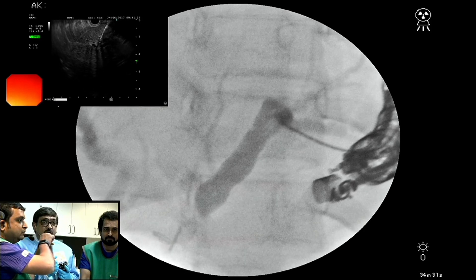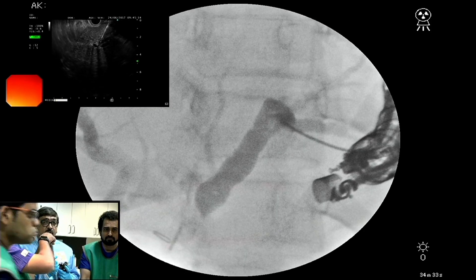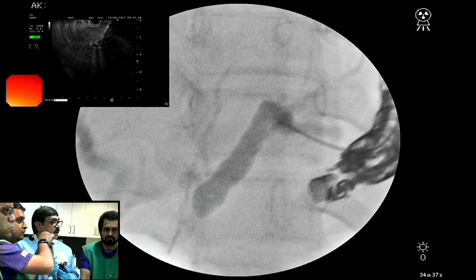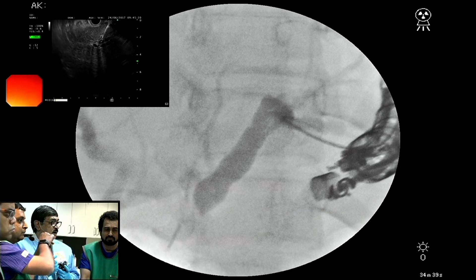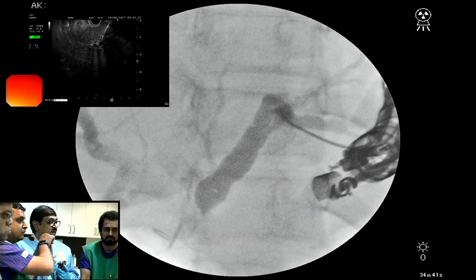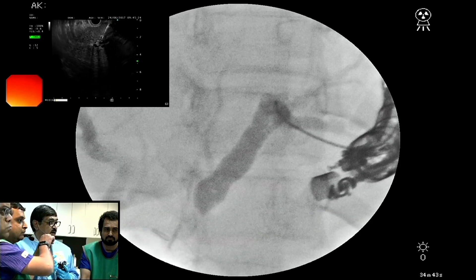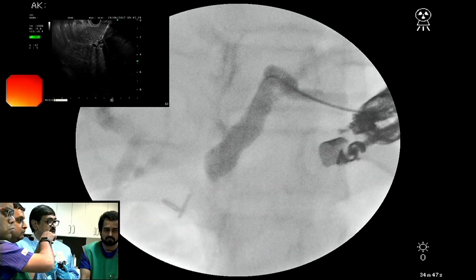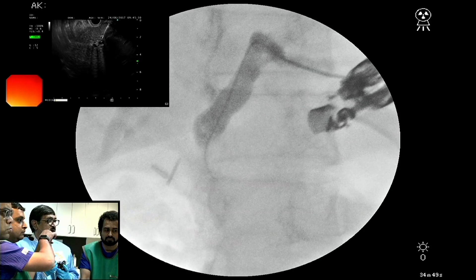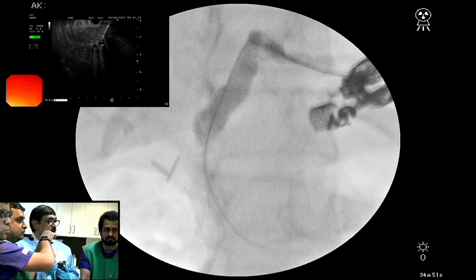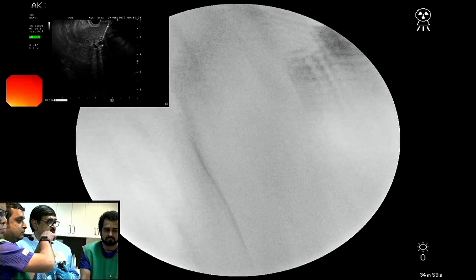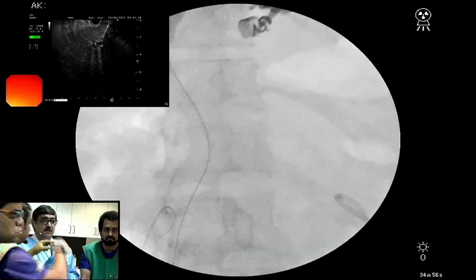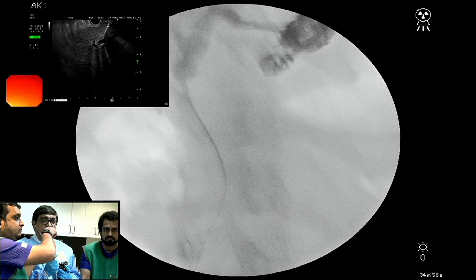I will withdraw a little more. You see the wire is going back, although the needle direction is towards the hilum. Now we have got it — we have gone down into the duodenum. Can you see the wire on the x-ray? Fantastic. So this is the critical step.